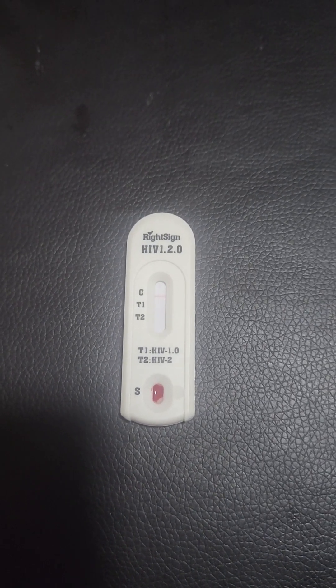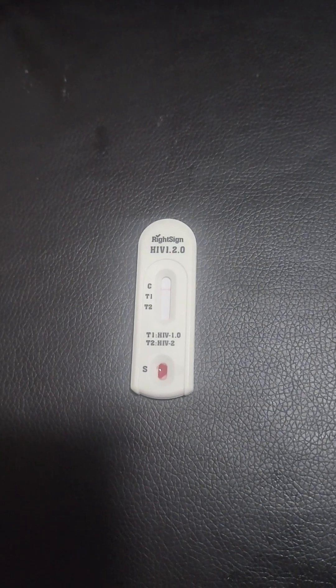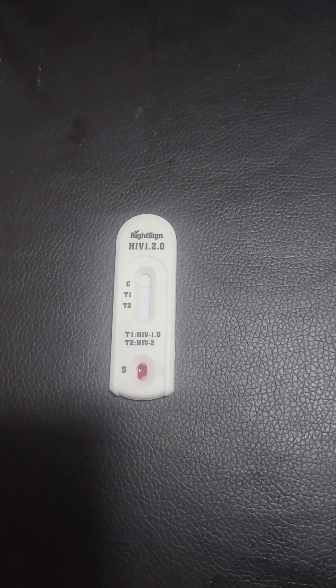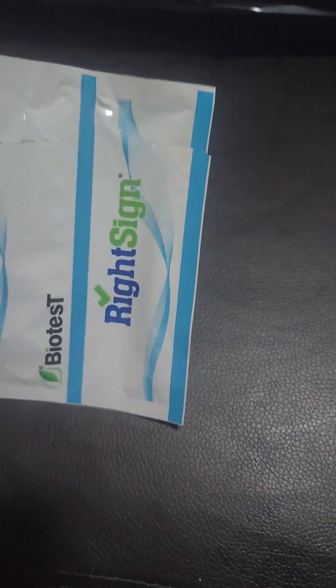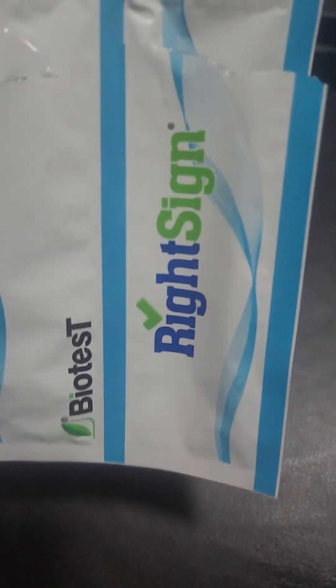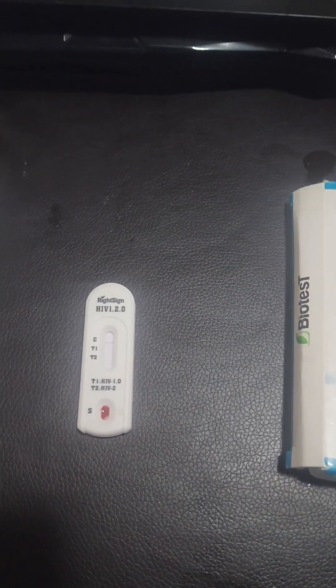Disposal of medical waste such as this should be as follows: you reinsert everything into your paper sheets and put it back into your box, and thereafter place it in a plastic bag, which you can then dispose of accordingly.